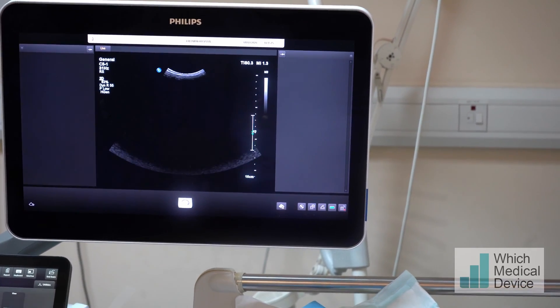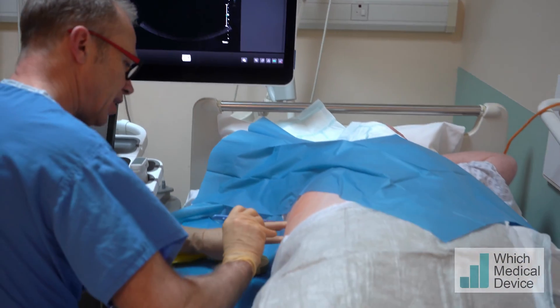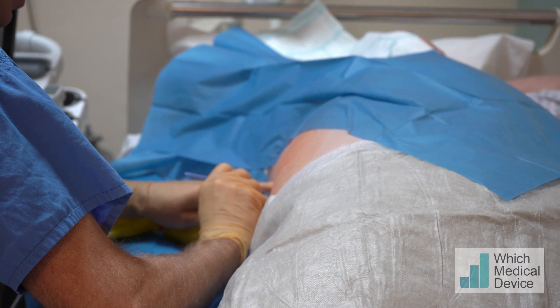Does that feel all right? Yes, good. Now it's going to make a small nick. Does that feel sharp in your skin at all? Very slightly. Does that feel sharp? No. Just a bit of pressure.